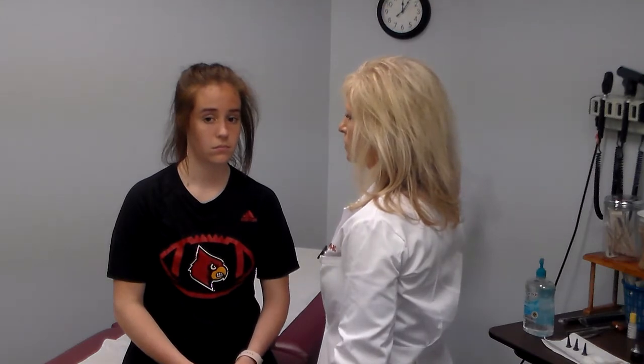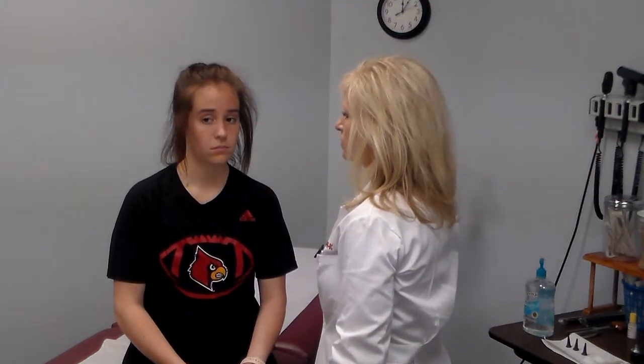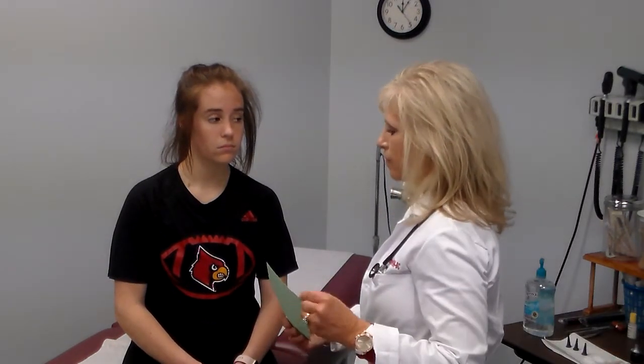Next, you're going to check visual acuity by using a Snellen chart or any other printed material available. You're going to measure from about 12 to 14 inches away, have the patient check both eyes together.